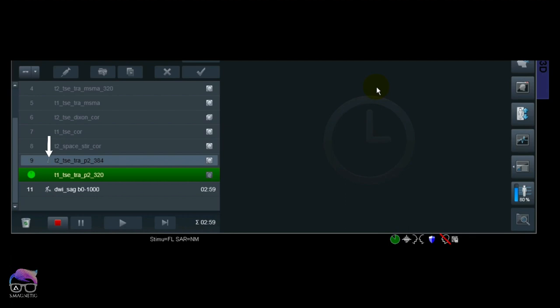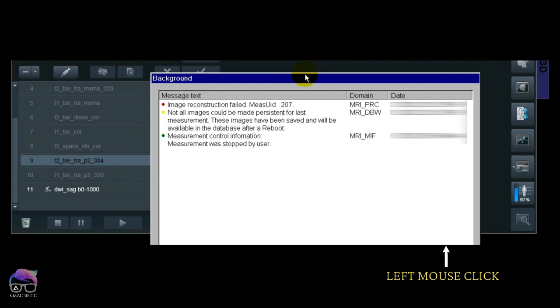means it's an error or broken—something is not right. If you look into the browser, you only see half of your images. I'll show you later. What you can do from here is check the error message down there. It says 'Image reconstruction failed. Not all images could be made persistent for last measurement. These images have been saved and will be available in the database after reboot.'